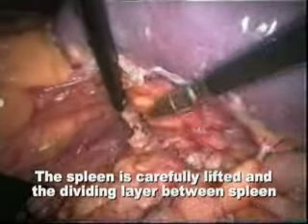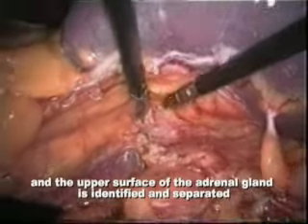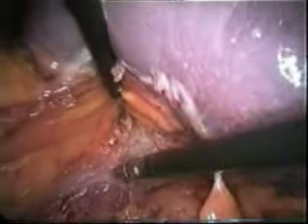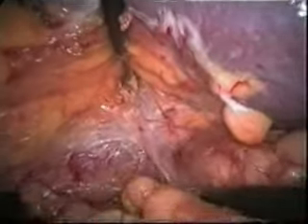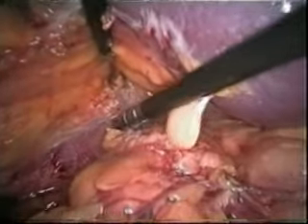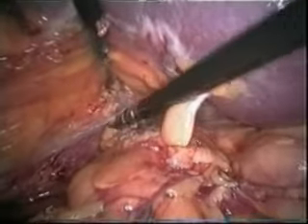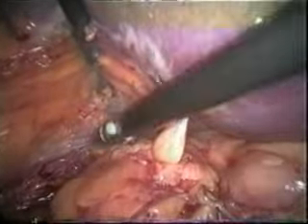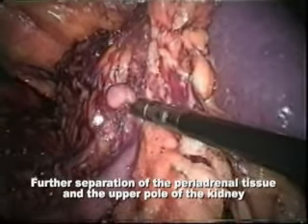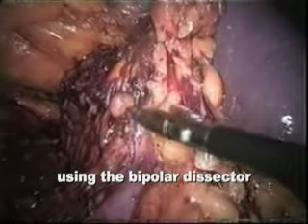The spleen is carefully lifted cranially, and the dividing layer between the spleen and the upper surface of the adrenal gland is identified and separated. Further separation of the periadrenal tissue and the upper pole of the kidney is done using the bipolar dissector.